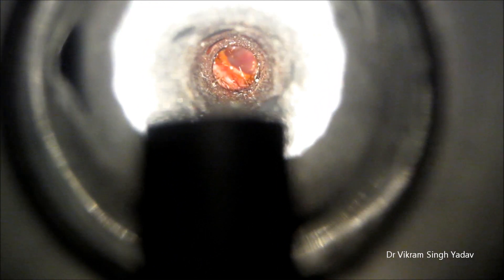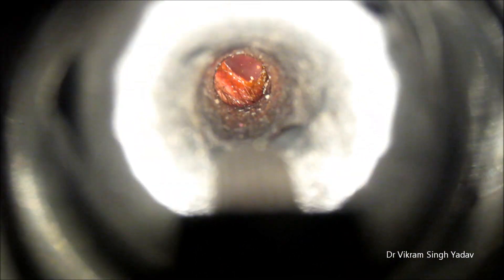Friends, people used to clean their ears with the help of a matchstick or by inserting any other foreign body in the ear, and sometimes they get injured.